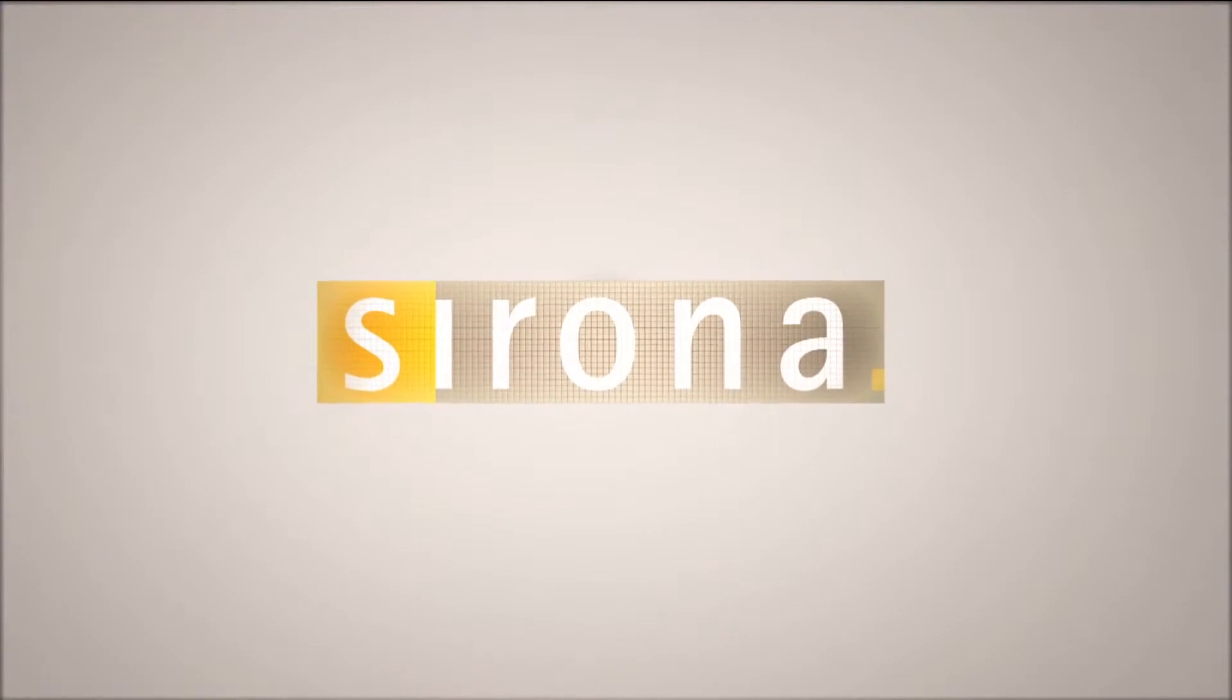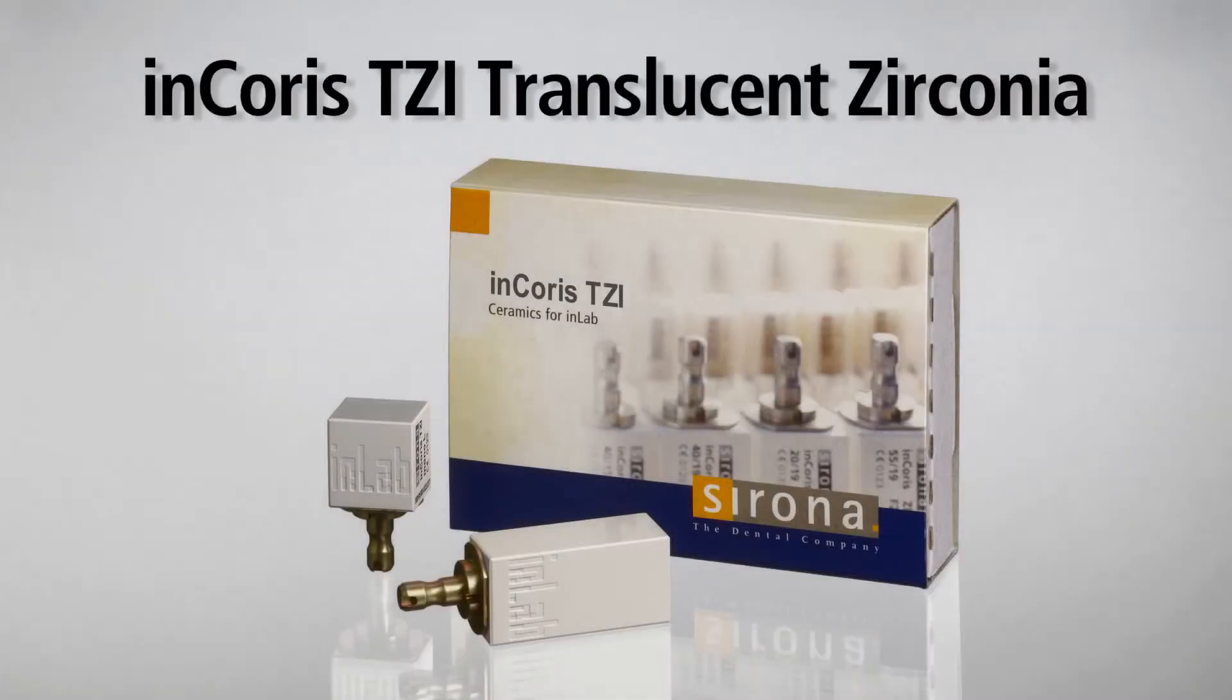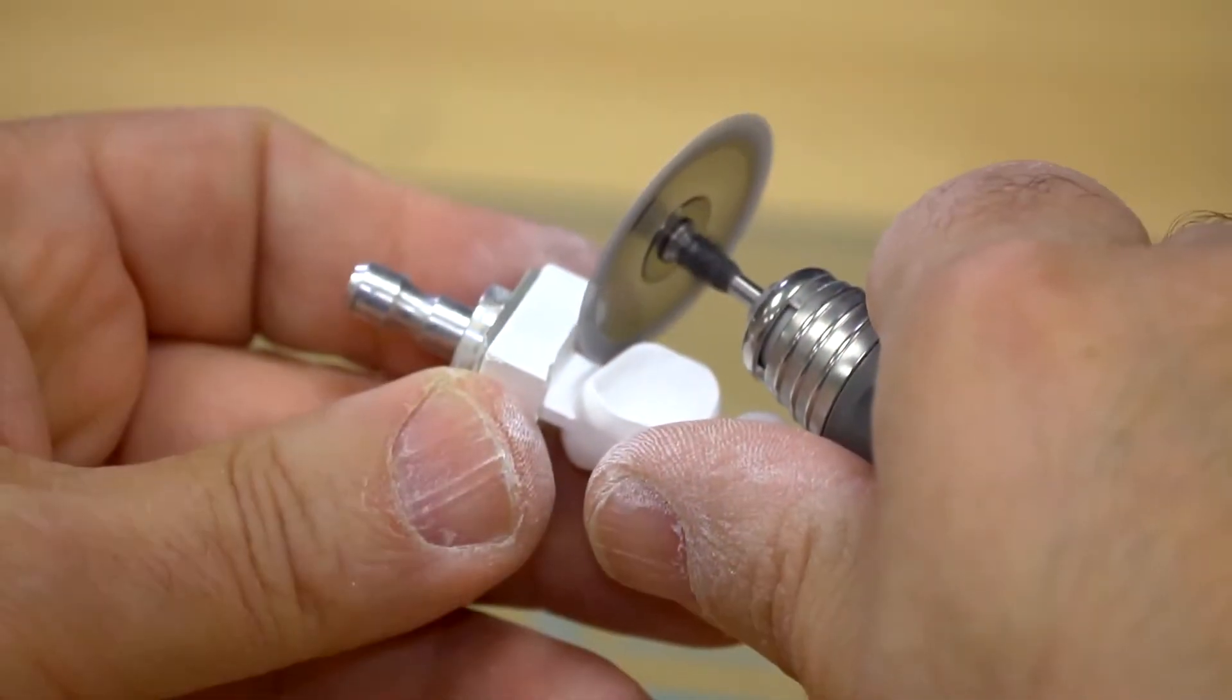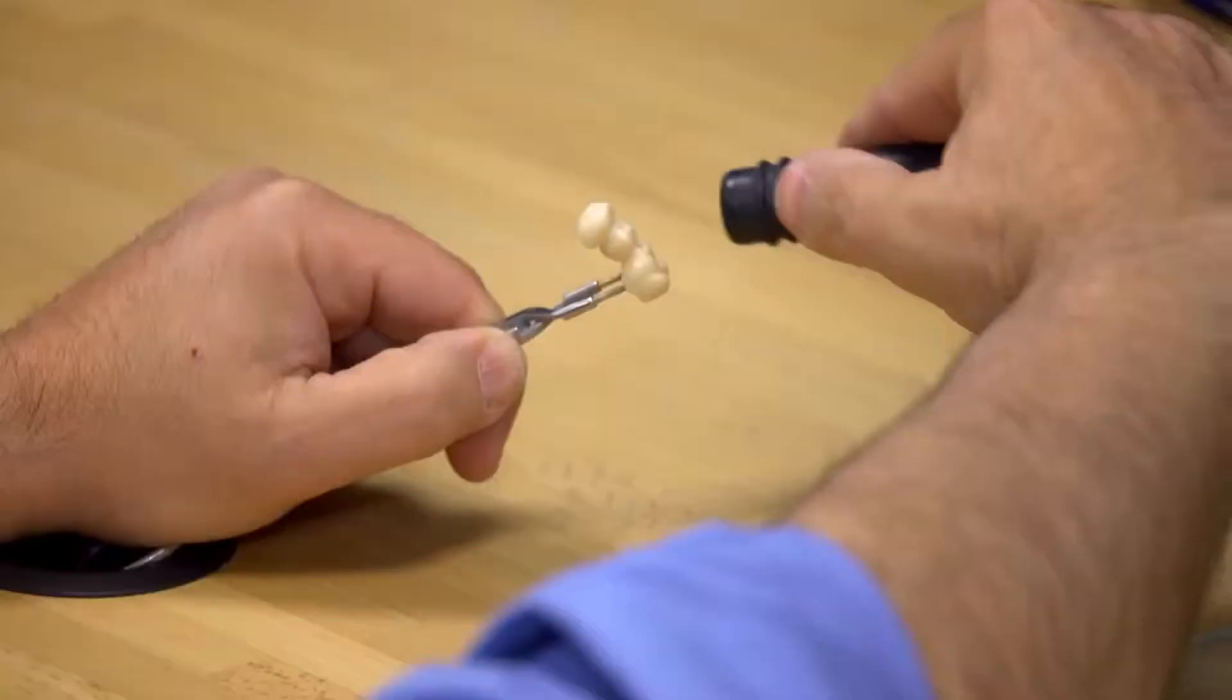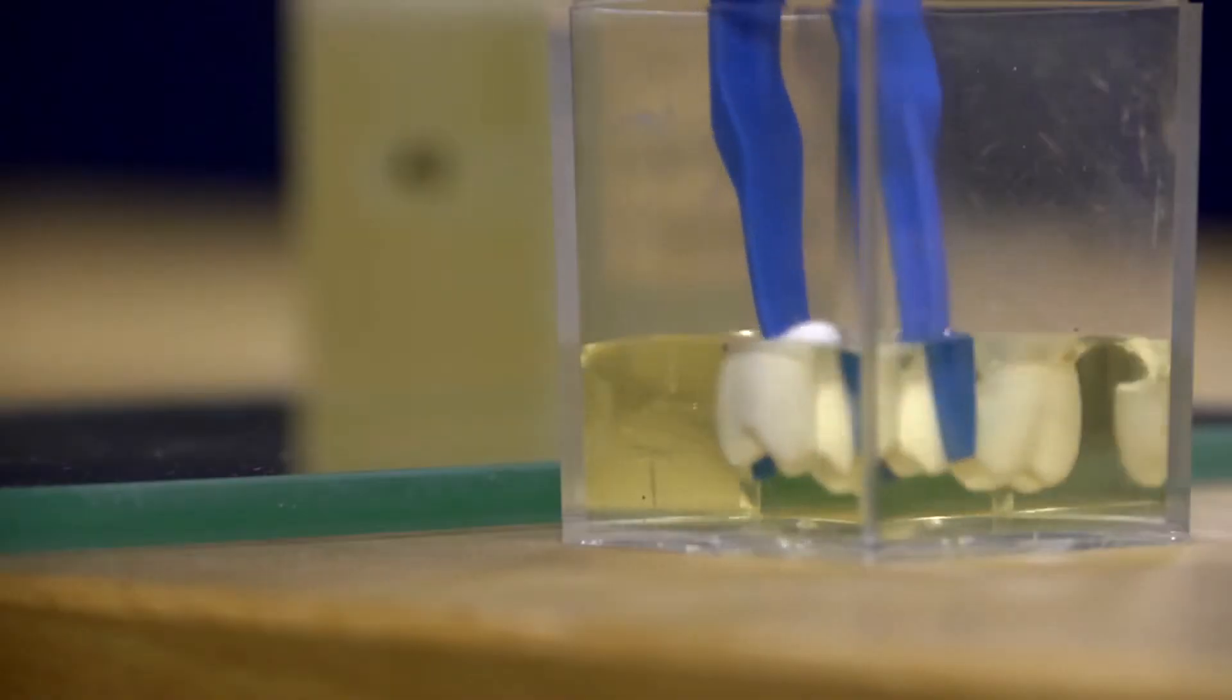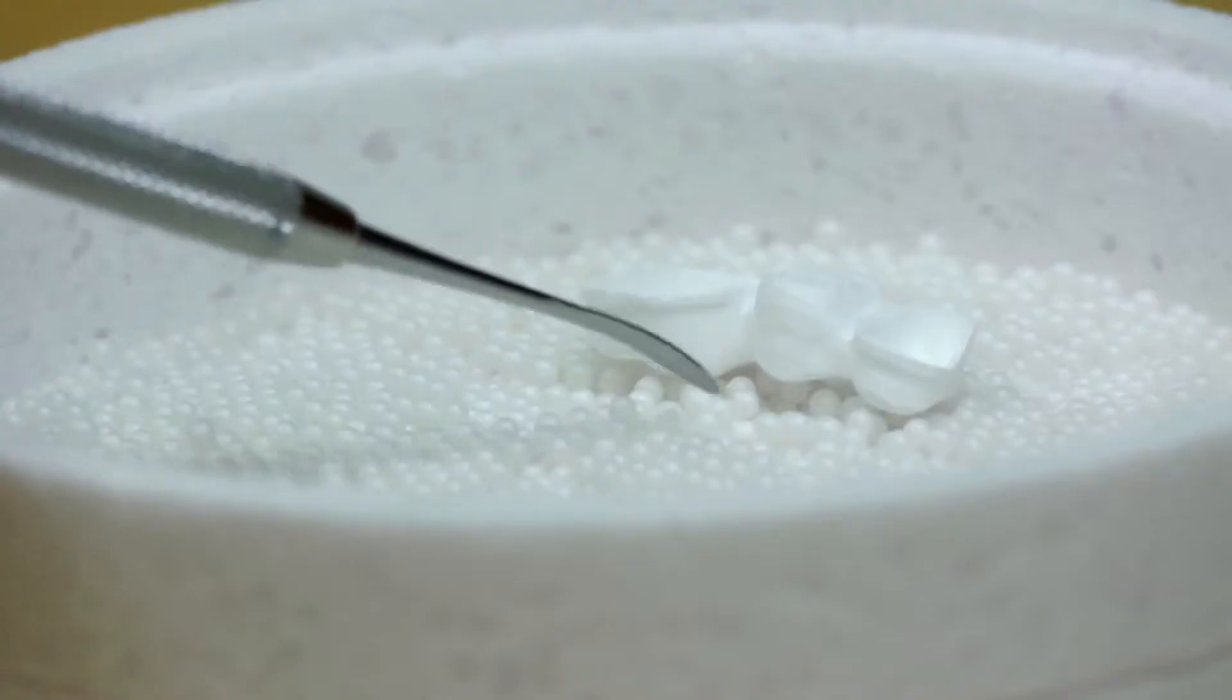In this tutorial, we will learn the necessary steps to mill and finish Chorus TZI Full Contour Zirconia Restorations with Sirona InLab. This revolutionary material provides highly translucent zirconia restorations with the ease and precision of the Sirona InLab family of products.